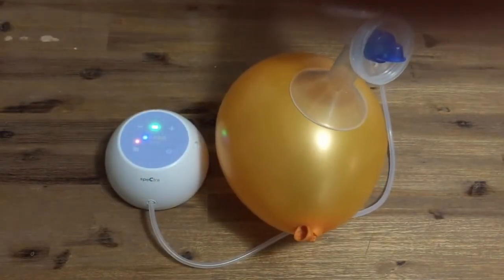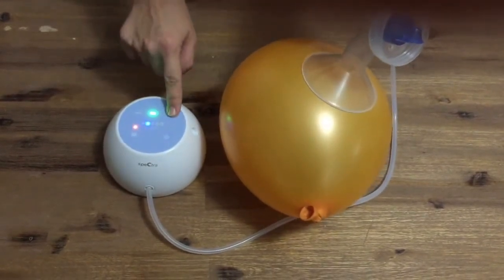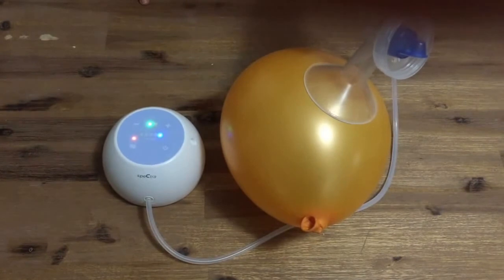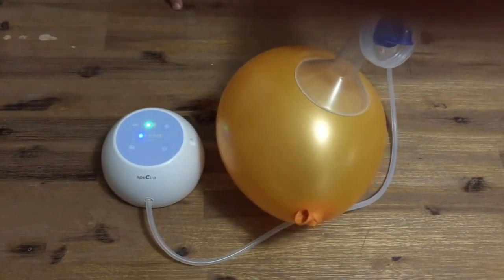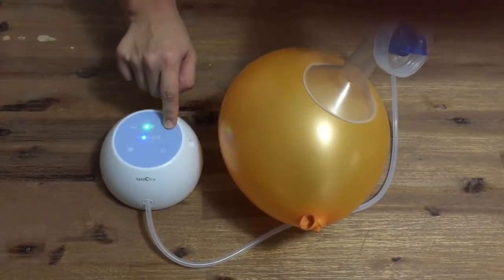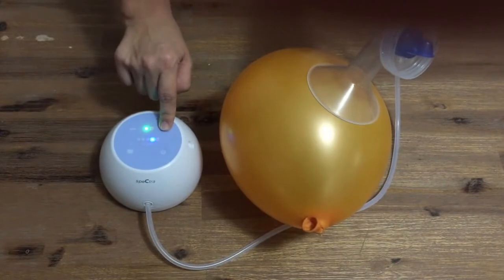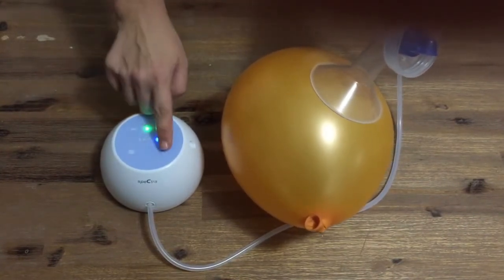Here is the M1 in let down mode on level 3 and on level 5. When switched back into expression mode, you will notice that the higher I increase the suction strength, the slower the cycle speed, all the way up to level 5.